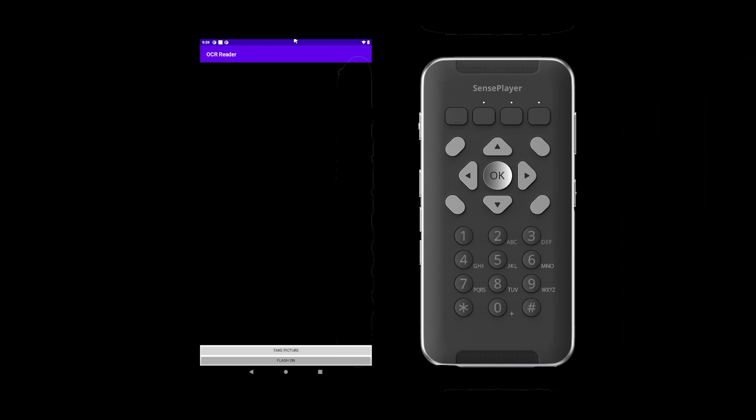Next, begin to take your picture by first going back to the take picture button by pressing the up arrow once. You can capture an image using the Sense Player camera in two ways: the first is by physically holding the Sense Player in an optimal position with your hands, or using the optional OCR stand.